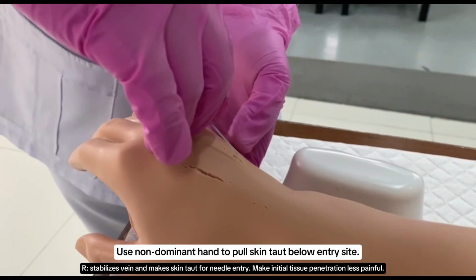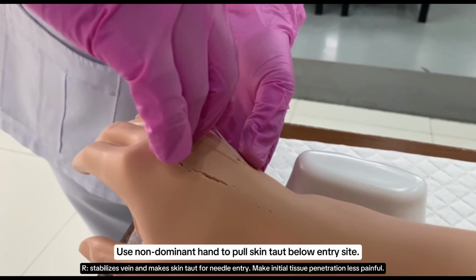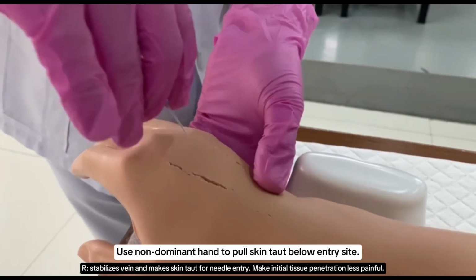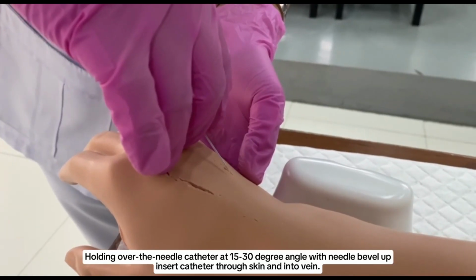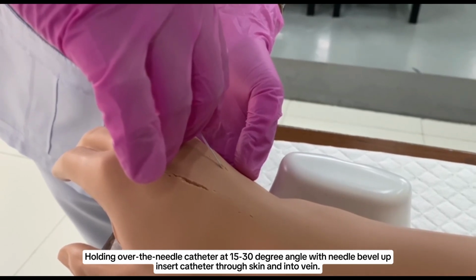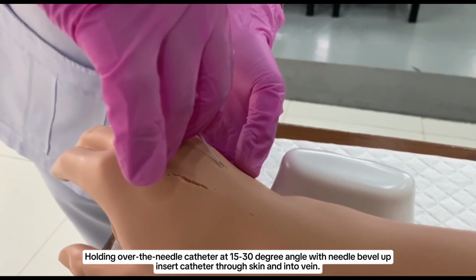Use a non-dominant hand to pull the skin taut below the entry site, because it stabilizes the vein and makes the skin taut for needle entry. Make initial tissue penetration less painful. Holding the over-the-needle catheter at a 15 to 30 degree angle with the needle bevel up, insert the catheter through the skin and into the vein.